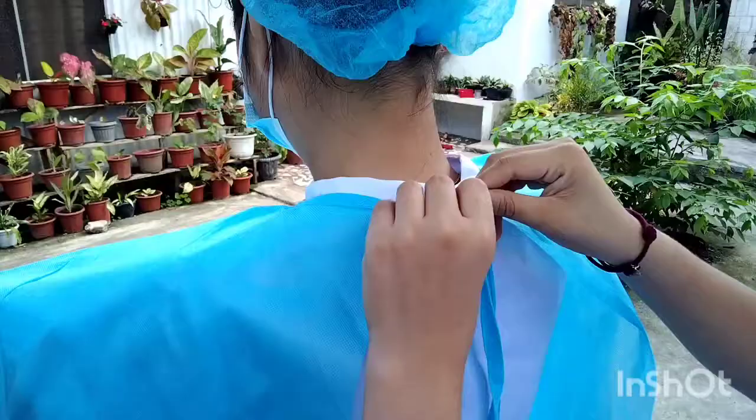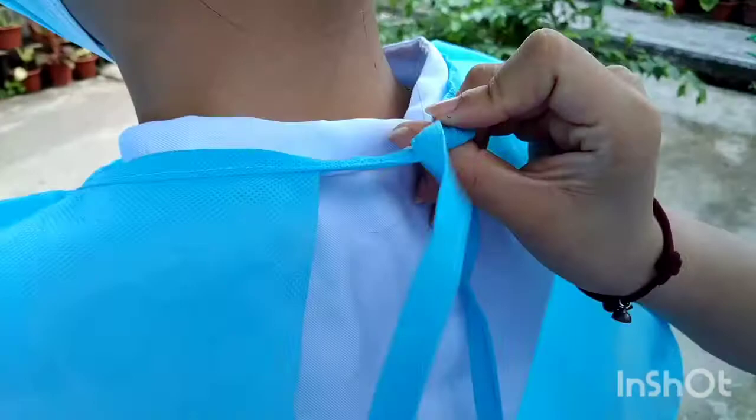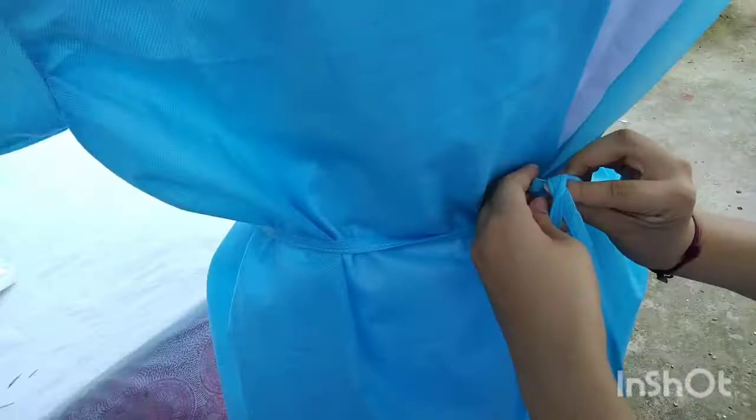After that, have the circulating nurse securely tie the back of the gown at the neck and waist. The gown must completely enclose the underlying garments.